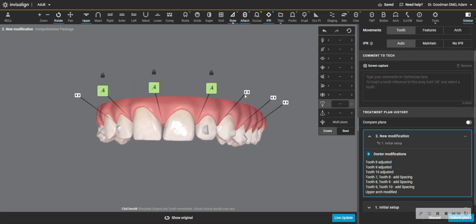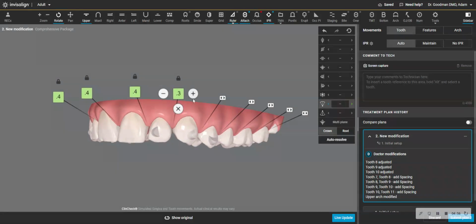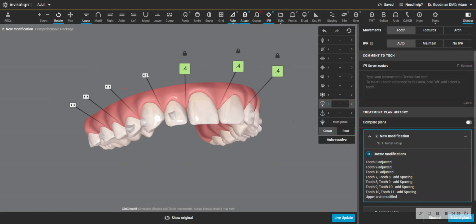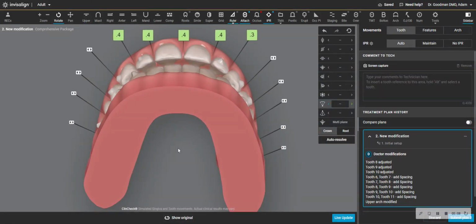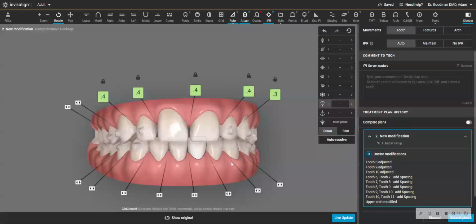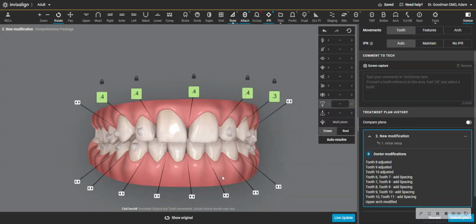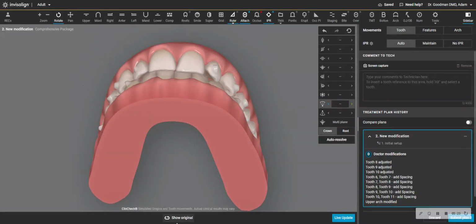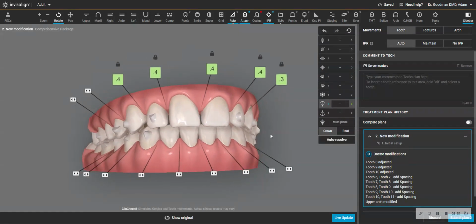spacing between the teeth. Now, the patient may not want this spacing, but if they're willing to do restorations afterwards, it would work out great. As an orthodontist, I don't look at everything like a tooth position problem. I look at things like a tooth shape issue. So now I have some anterior clearance to support and to allow for ceramic material to be placed without affecting the bite. These are no prep veneers. Now I have a simple Invisalign case with tooth tipping forward, creating spaces between the teeth, all ready to go for veneers at the end of the treatment.